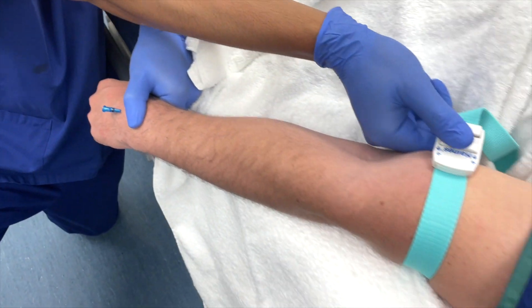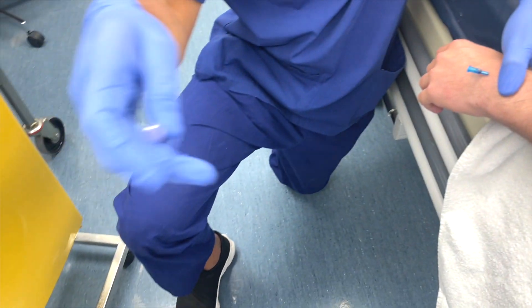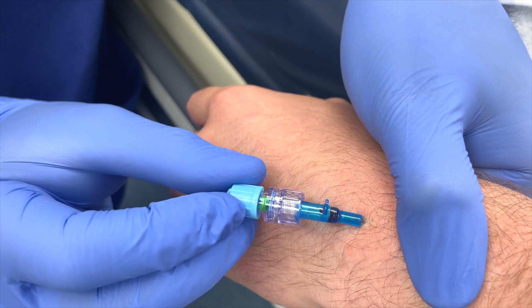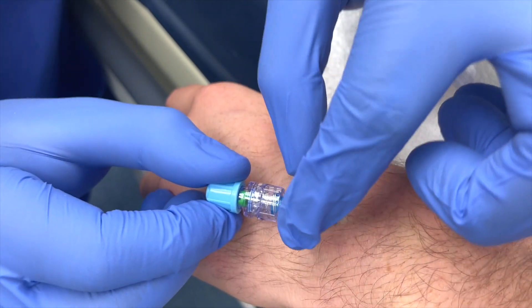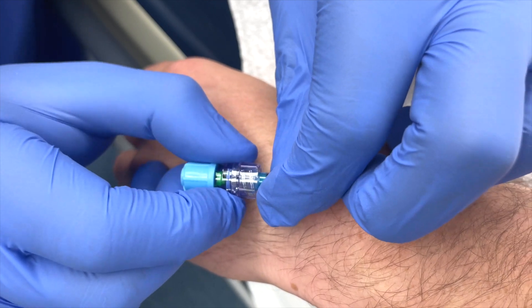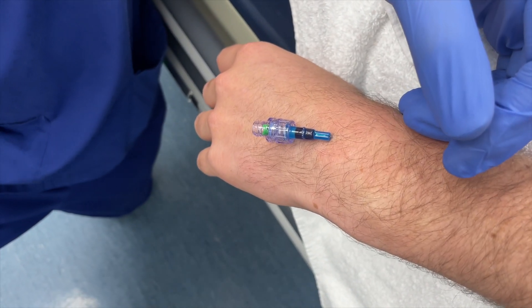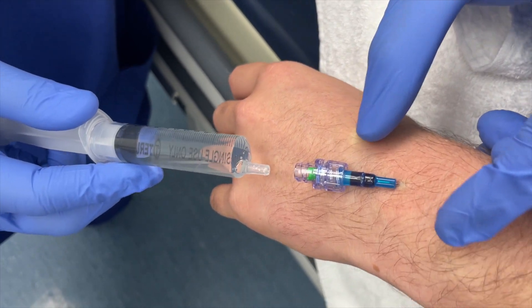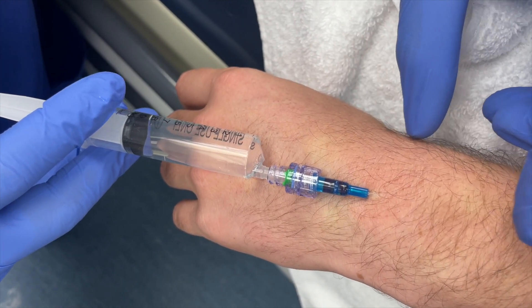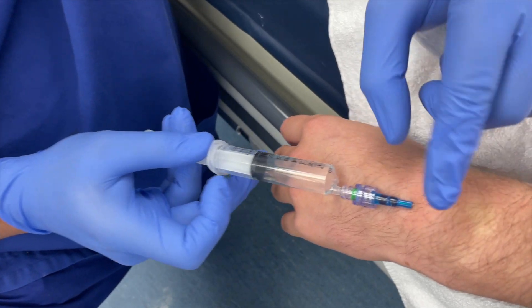I put my thumb proximally and feed the needle off — that needle goes straight to the sharps bin. My other hand goes to the tourniquet to ease the pressure. I take the IV bung with one hand and, without a spare hand to stabilize the cannula, I jiggle it on — which is absolutely fine. I transfer my hand, make sure the bung is nice and tight. My very next step is to flush before I put the Tegaderm on, just in case I need to withdraw or reposition the cannula. It flushes easily.